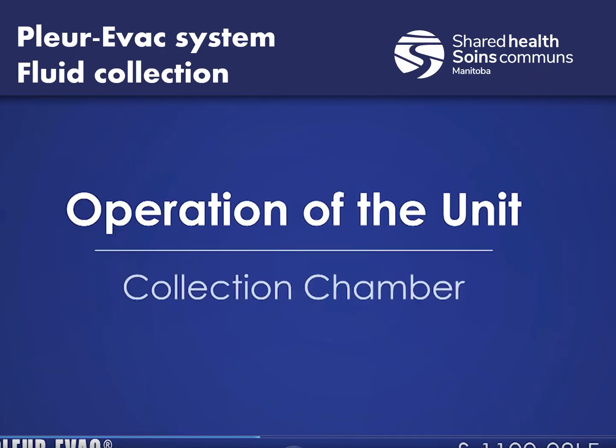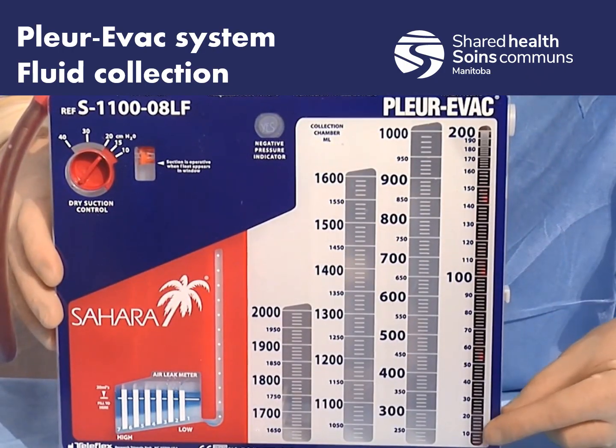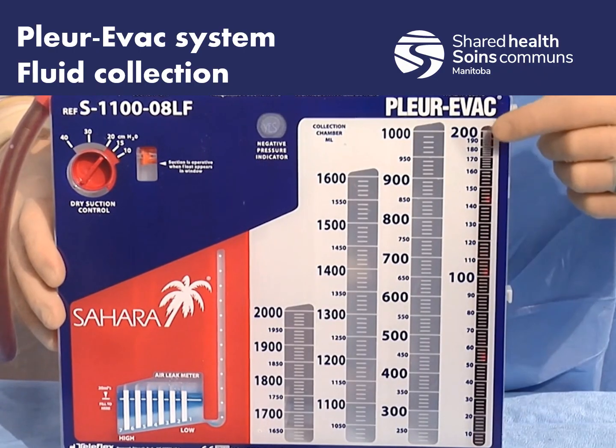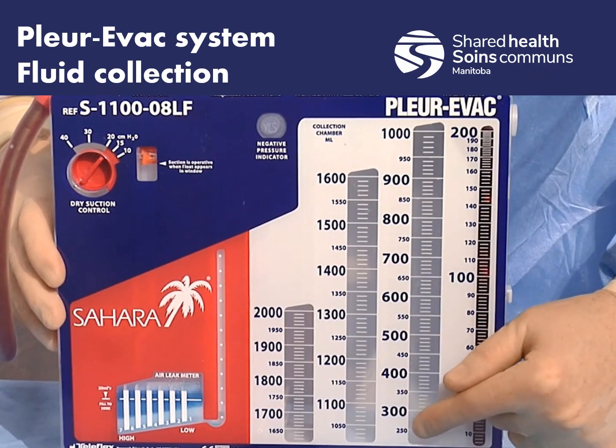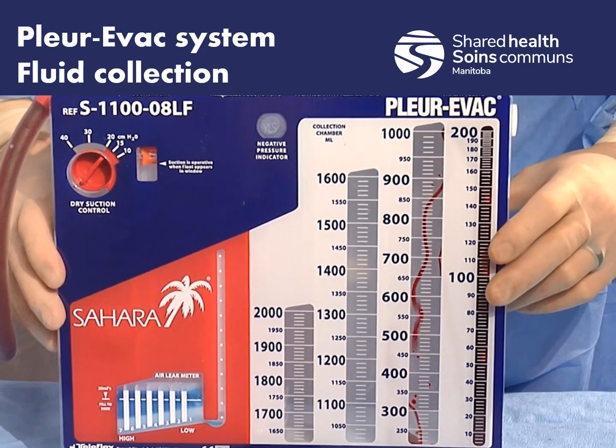So in the collection chamber itself, like I mentioned before, it has a 2-liter capacity. The chamber is calibrated in 2 ml increments up to 200 cc's, and then 10 ml increments after that. So we want to make sure we document how much was in there when we started a transport and how much is there after we get to our receiving facility. Fluid, whether it's blood or pus, just flows into each chamber up until 2 liters. Make sure to document what was in there, if anything. If it's got nothing in there, document that too. So document the amount in there at the start of your transfer and how much is there at the end of your patient transfer.